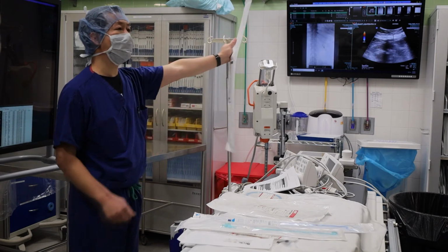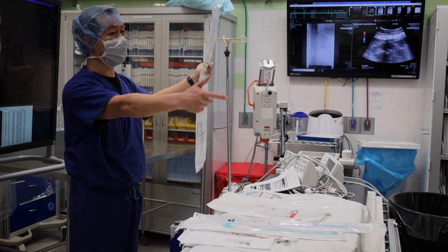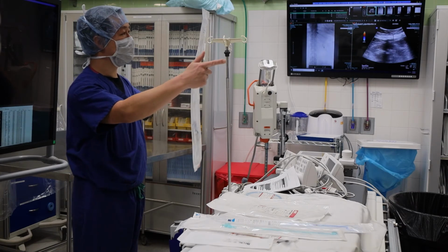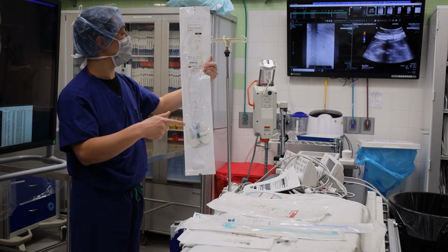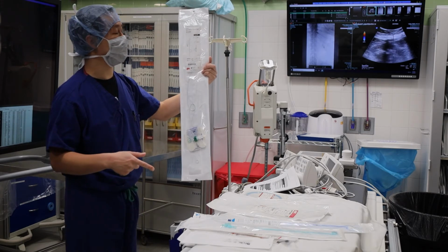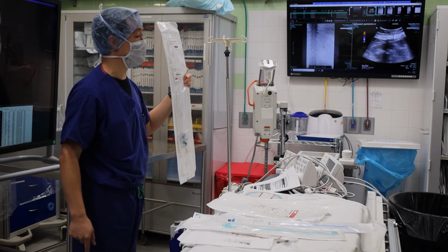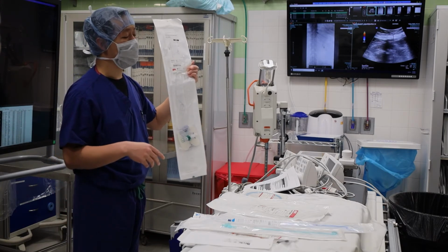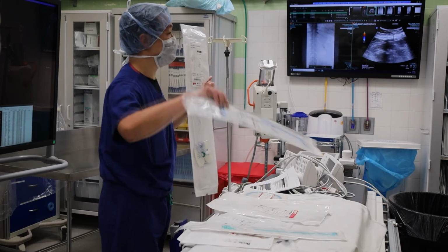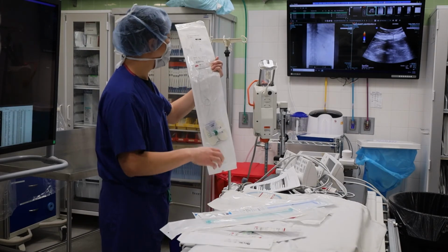Okay. Do you know what size these come in? So diameters and lengths. So 13 and a half, and 26, 24, 22. Yeah, so the 13 and a half is like a specialty product. Okay, so these come in 8.5 and 10.2 French. Okay, those are just the only two sizes, simply because those are the sizes people make, right? 8 and 10. And so they come in different lengths.